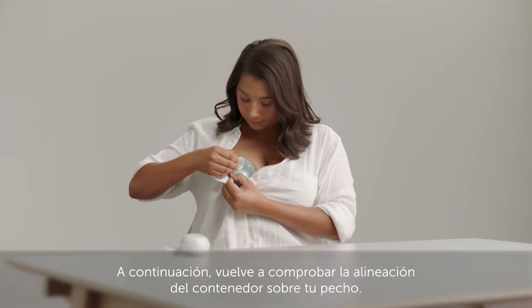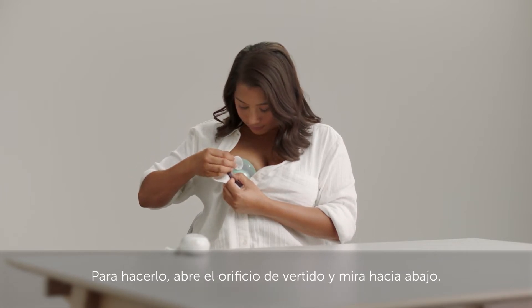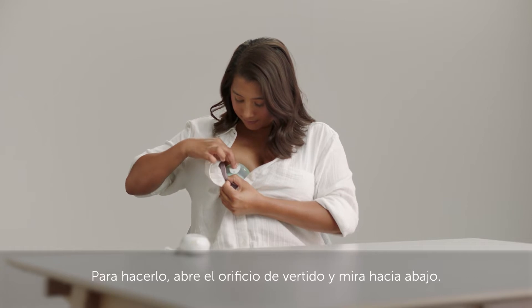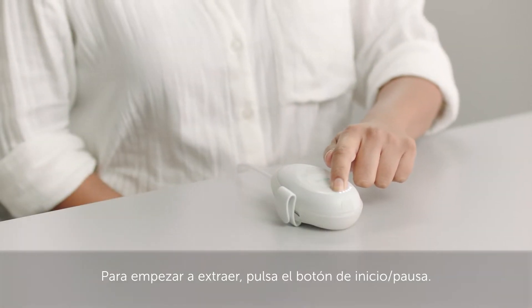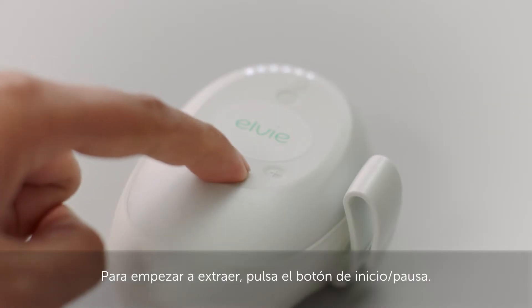Next, double check the cup's alignment on your breast. To do this, open the pore hole and look down it. Turn your pump on by pressing the power button. To start expressing, press the play pause button.